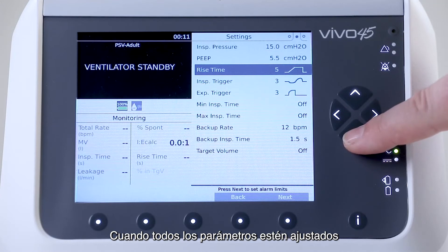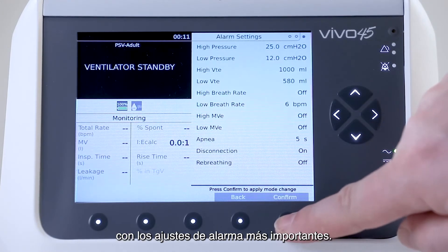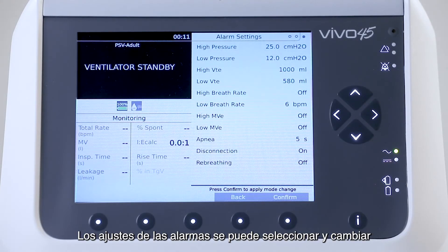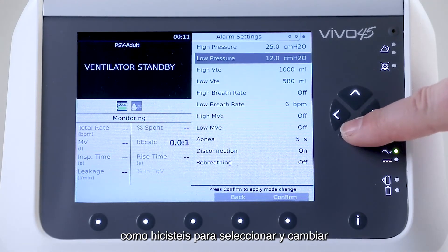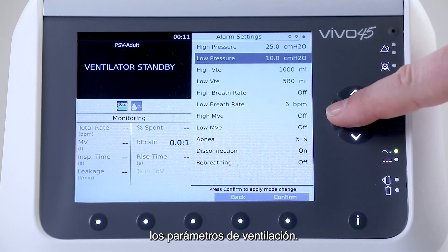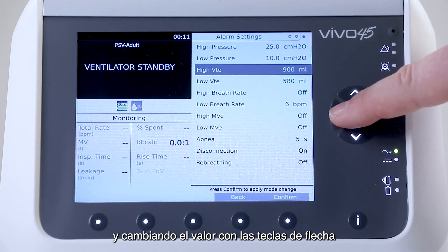When all parameters are set the way you want, you press next, and you will see a list with the most important alarm settings. The alarm settings can be selected and changed by using the arrow buttons in the exact same way as you did to select and change the ventilation parameters — selecting with the arrow up and down, and changing the value with the left and right arrow keys.